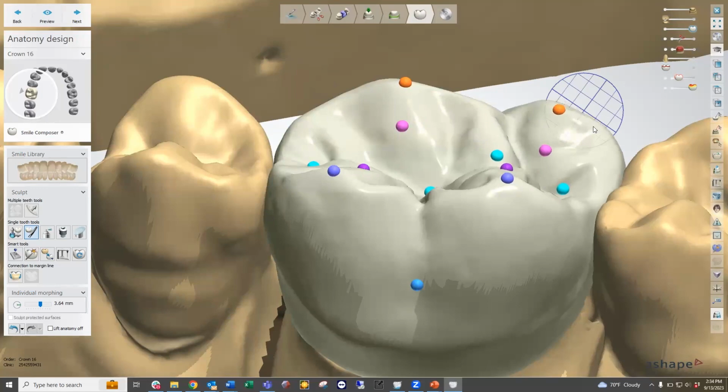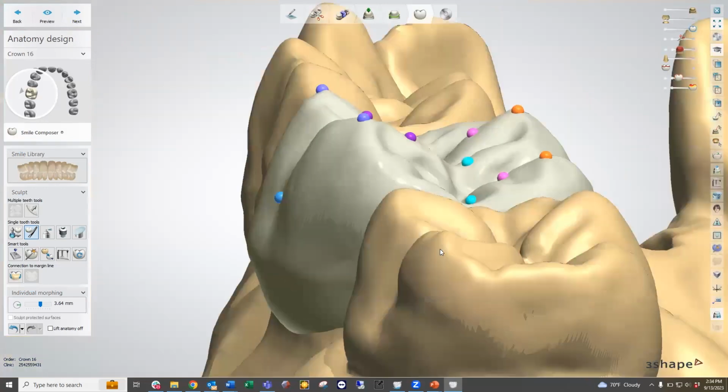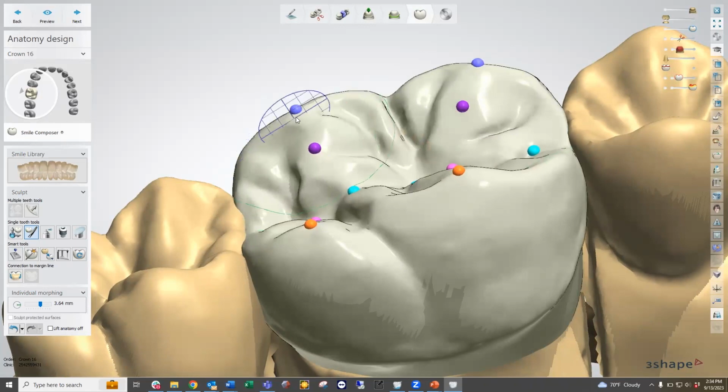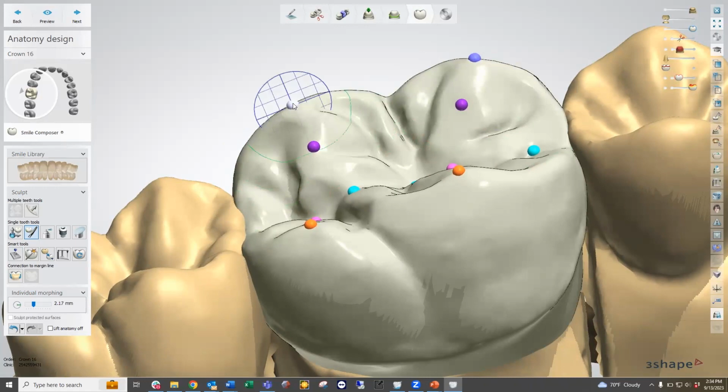Okay. So here, again, we're just using those intermediate changes to make the adjustments that we want to finalize our design. I'm changing my view constantly because I want to make sure that I'm true along all areas. I'm going to sculpt this down a little bit more. Maybe I want to sculpt this up. And you can also see the green circle that we have around here. That's going to be our area of effect. So if I only want to affect a small area, I can change that by hovering over a dot and changing the size with the scroll wheel of our mouse. Or I can use the shift button and scroll wheel the mouse. So I can either use the shift or just hover over one of the dots with the scroll wheel. But the scroll wheel is changing the circle size.